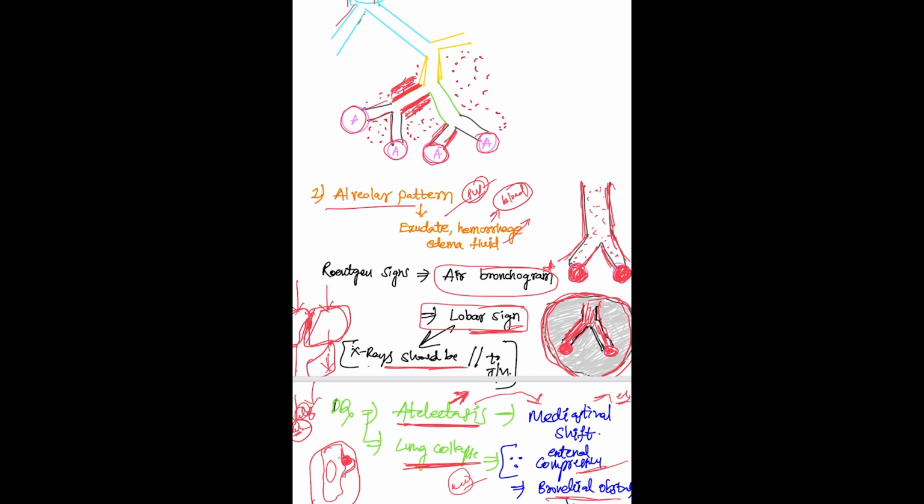Technically the anatomical position, the affected region, is the interstitium, but the pattern we will see here is the bronchial pattern. So the pathological radiographic signs may not always be related to the actual anatomical disturbance in the lungs.